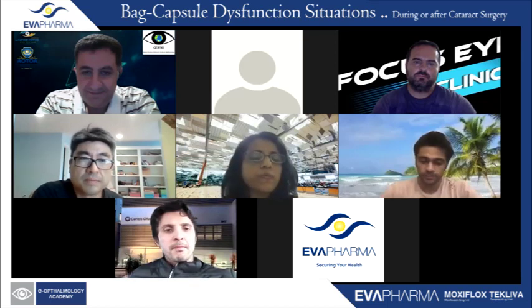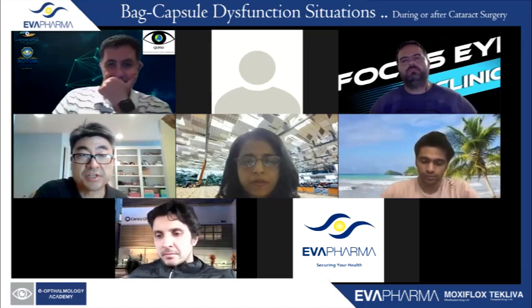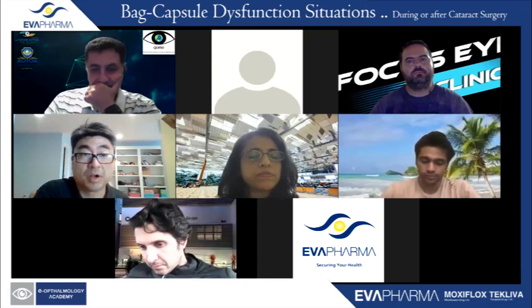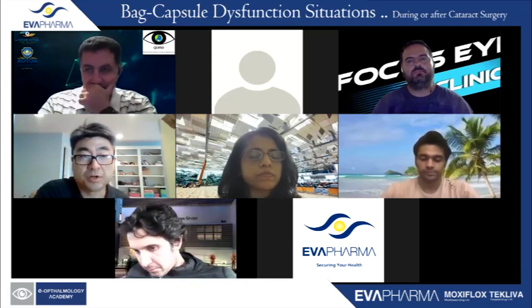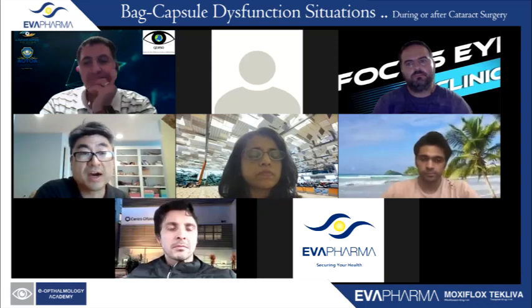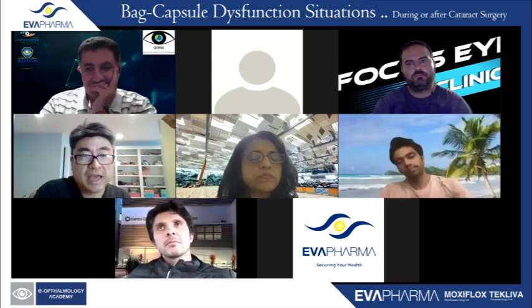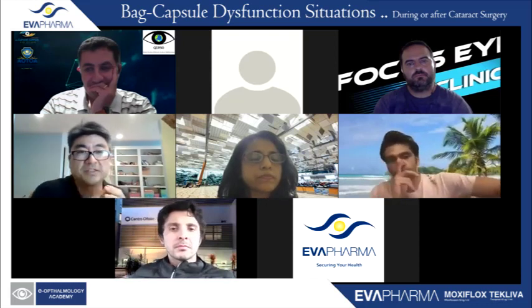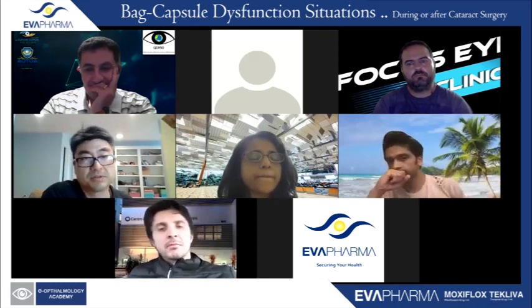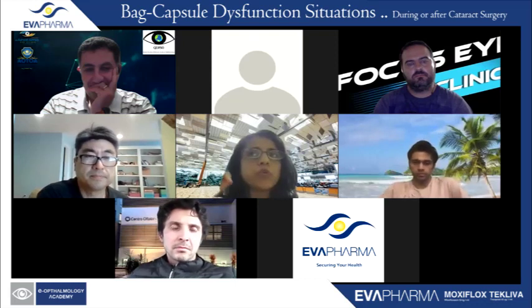Okay. I think that some surgeons have talked about if you have some decentration, as long as you don't have tilt, you could have some asymmetric bulb shrinkage, or you can alternatively, if you don't want a huge flange, you can go ahead at that point, cut the bulb and then start over. So if you have a slightly decentered lens, that could solve that problem, but only if there's no tilt. But otherwise, what are you aiming for when you first start putting that low temp cautery?